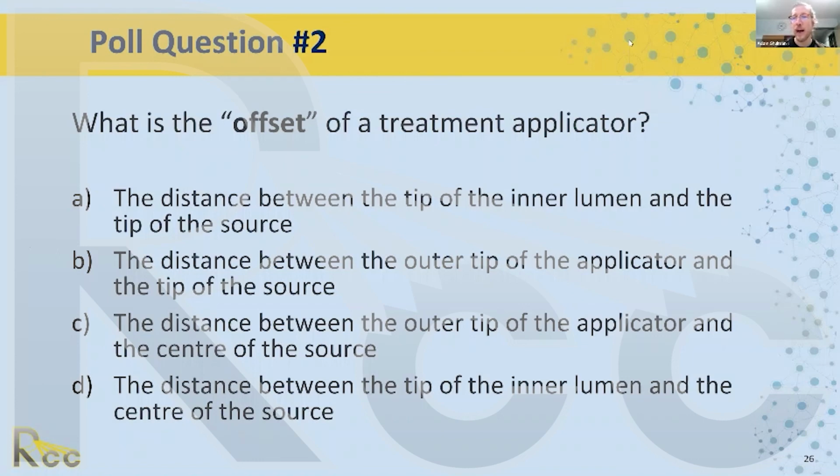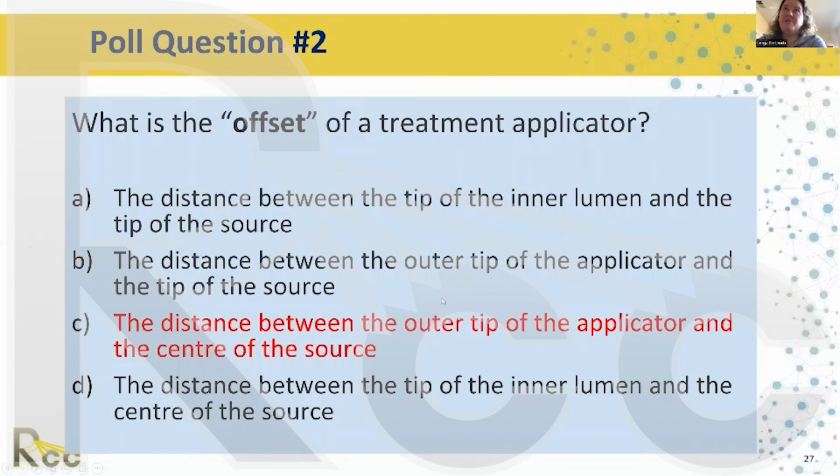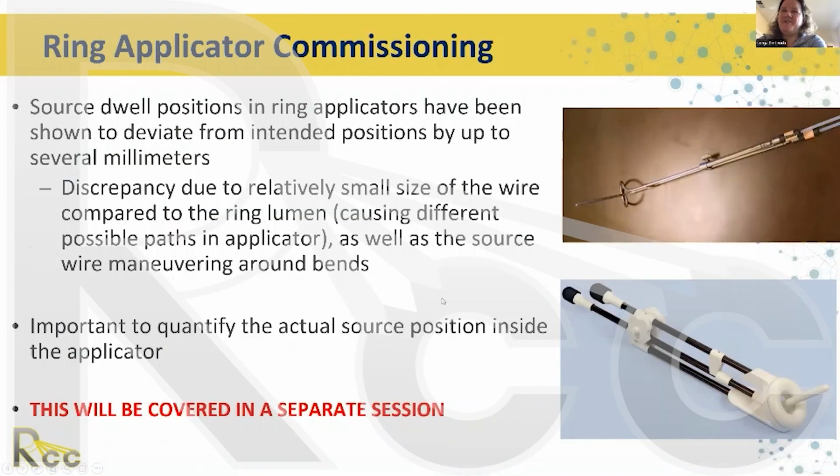And then after that, you'll take an autoradiograph, and you should be able to see, centered inside of that dark exposure on the film, that marker, the marker wire with that little dummy dwell position. You can see that they overlay perfectly. So yeah, very, very good question. So multiple ways to get there. It's actually a good comment on everything here. There are multiple ways to do this applicator commissioning.